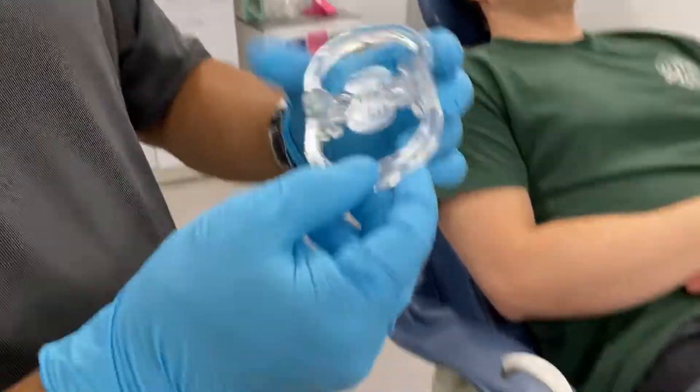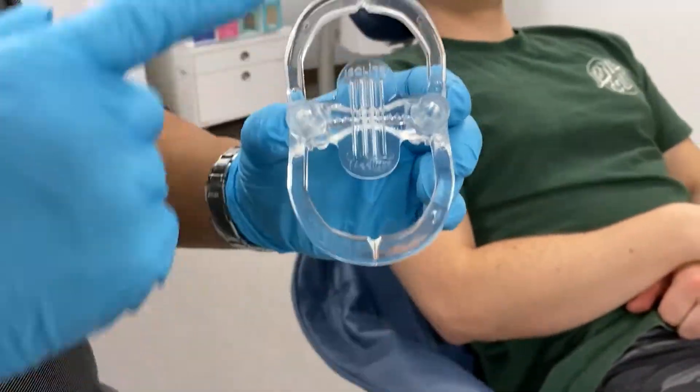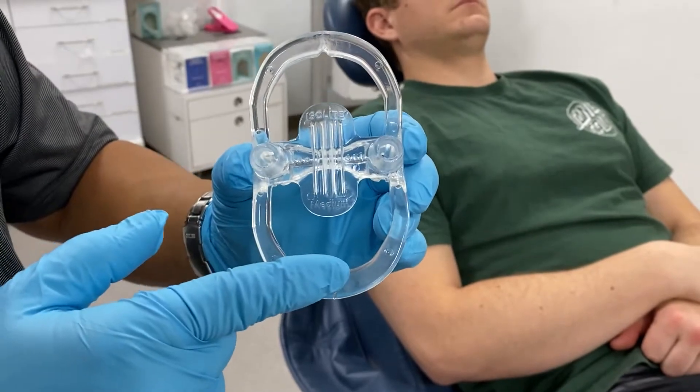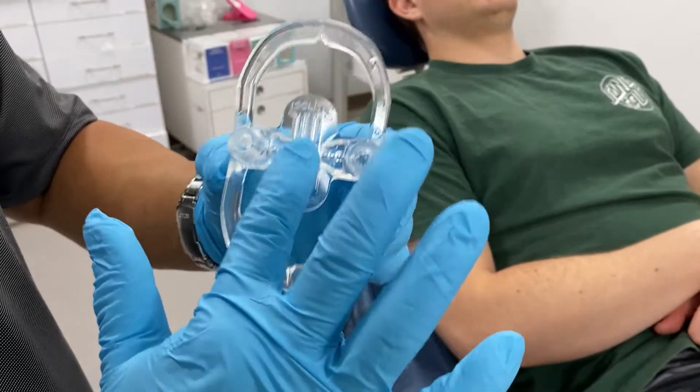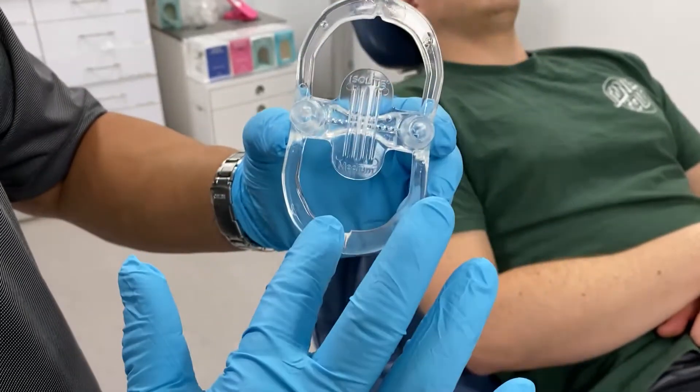Every one of the Isolite anterior mouthpieces are shaped the same way. There's no difference between the upper and lower, but there is a difference between the front and the back. This is your tongue guard and these are your lip retractors.